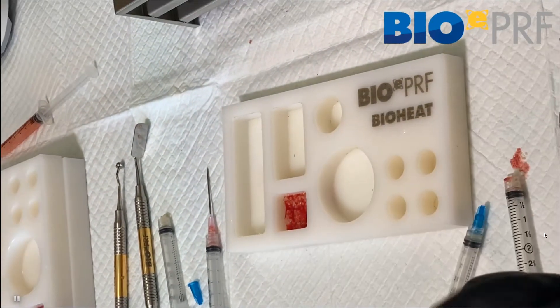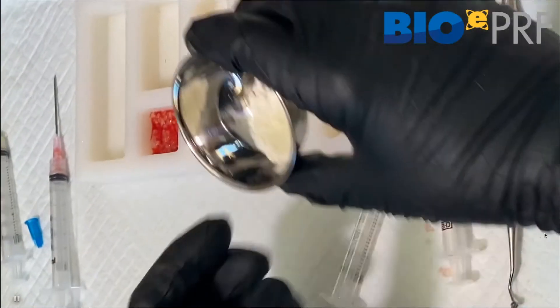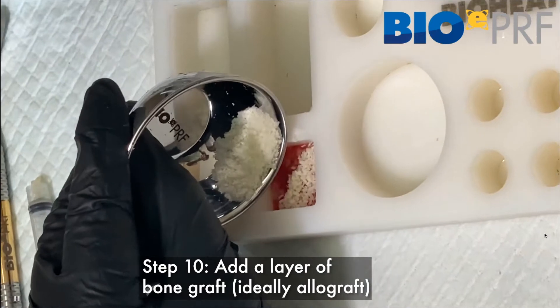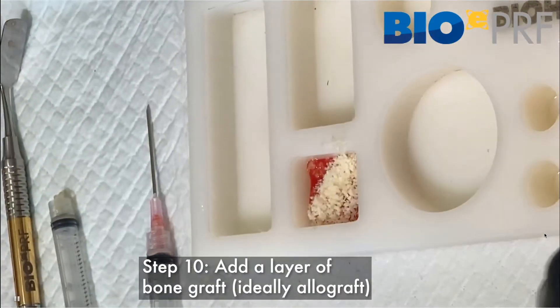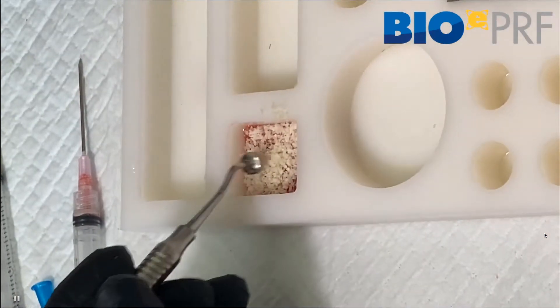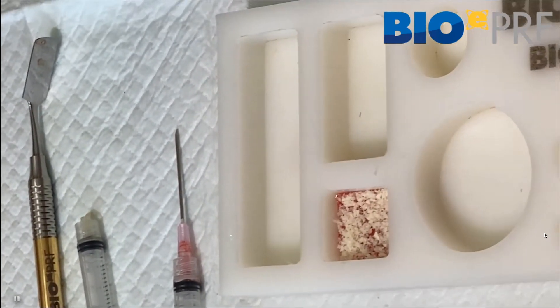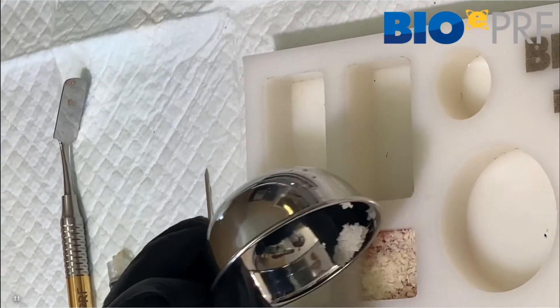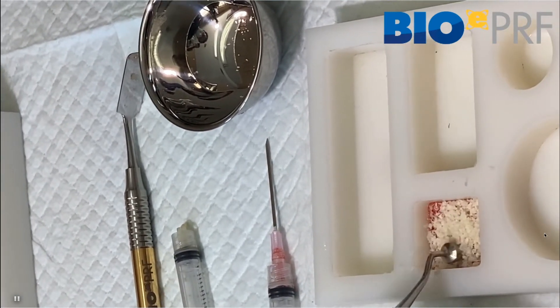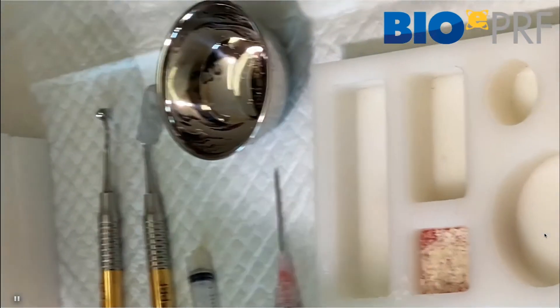Before it's done clotting, we can now introduce the allograft bone. The advantage of this technique is that we can combine the sticky bone we're used to working with from before, with an outer extended PRF membrane. Using the little compactor, make sure the allograft is evenly distributed. Depending on the size of the augmentation procedure, that's how much bone you'll utilize. For example, if you need a large five millimeter augmentation horizontally, you need five millimeters of bone allograft.